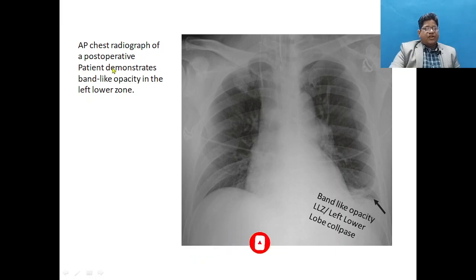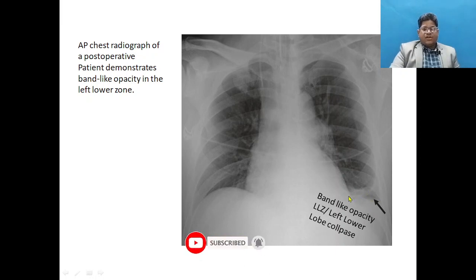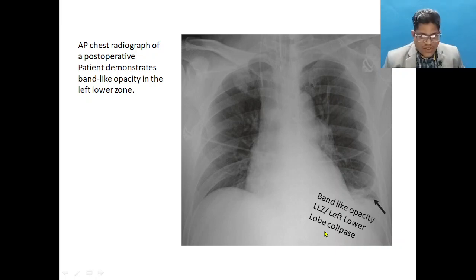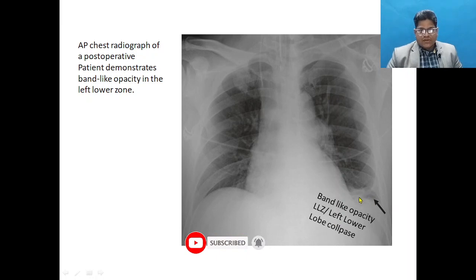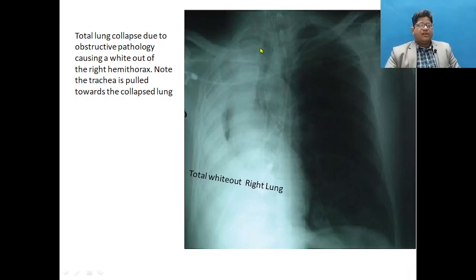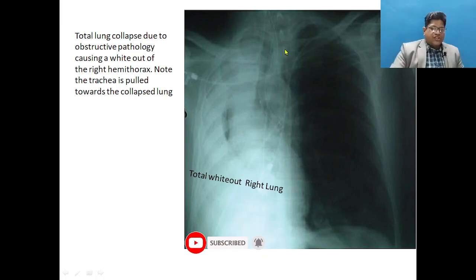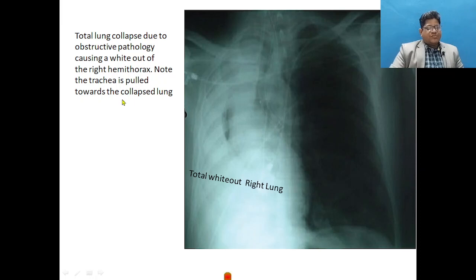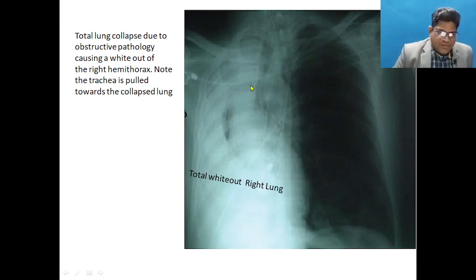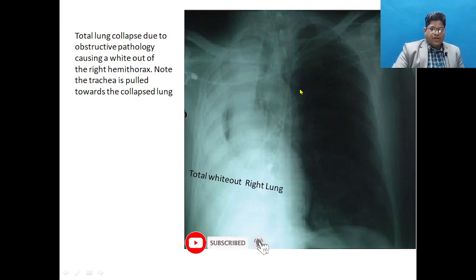This AP chest radiograph of a postoperative patient demonstrates a band-like opacity in the left lower zone representing left lower lobe collapse. In another example, the entire right hemithorax is completely white — a white-out lung — with the trachea, heart, and mediastinum all pulled toward that side, and compensatory hyperinflation of the opposite lung. This is right total lung collapse; in a ventilated patient this could be due to major airway obstruction or mucus plugging.